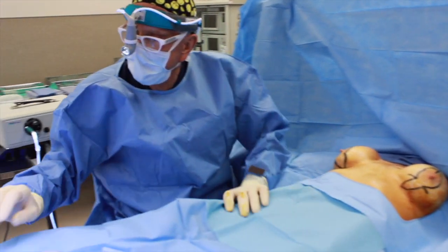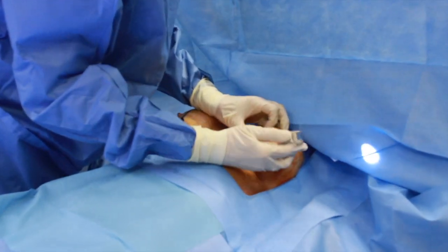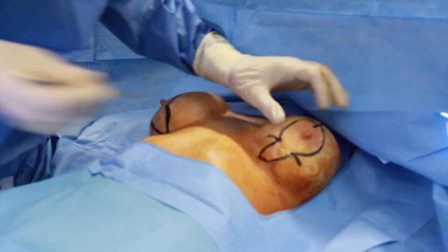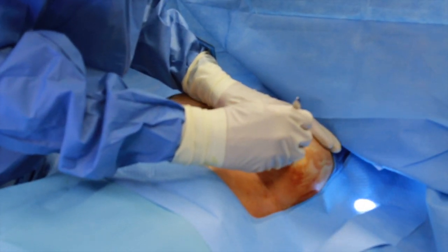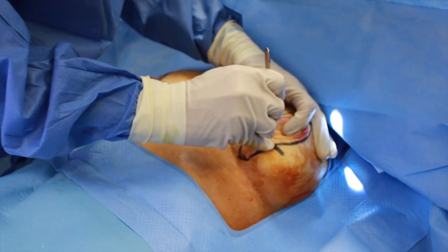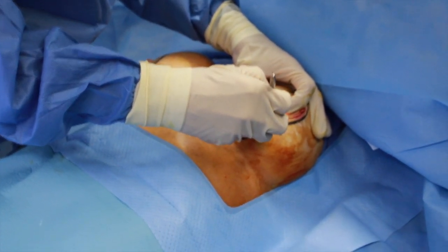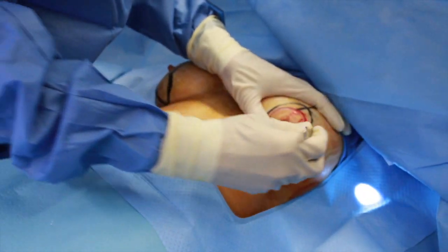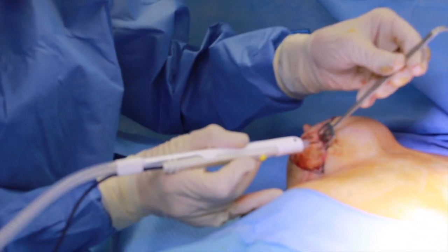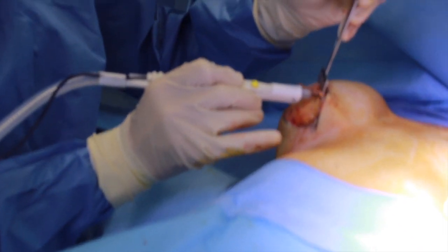The first thing we're going to do is make an incision around the areola for that part of the areola we're going to keep. We're going to get rid of the extra skin inside this pocket and then go down and take out the old implant. As you can see, we've removed the excess skin, and now we're going to raise little skin flaps so that we can pull it together after we've taken out the old implant and the scar tissue.